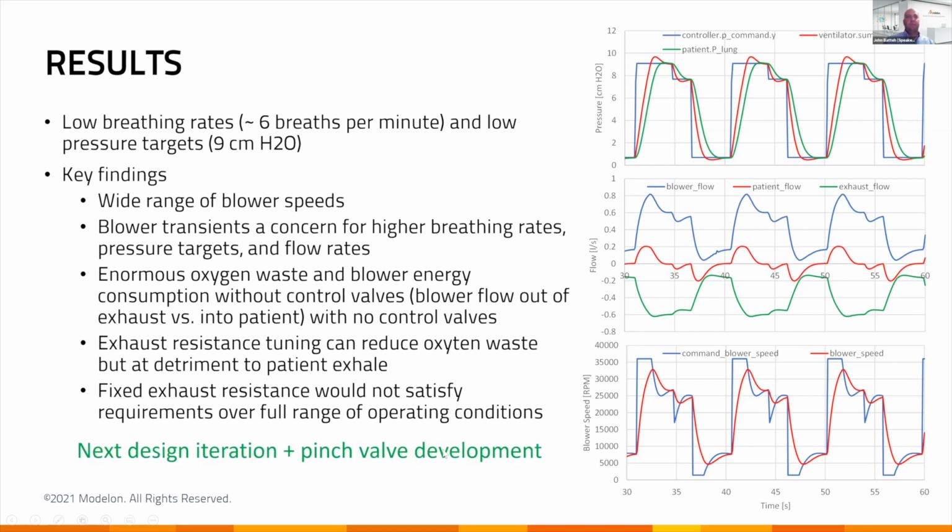So this was a very interesting result. It led to the next design iteration and actually led directly to the development of the pinch valve. When we showed some of these results, and also what happens as we ran at other conditions, the team was actually a little bit shocked that it was as bad as it was, and quickly started the development of the pinch valve.